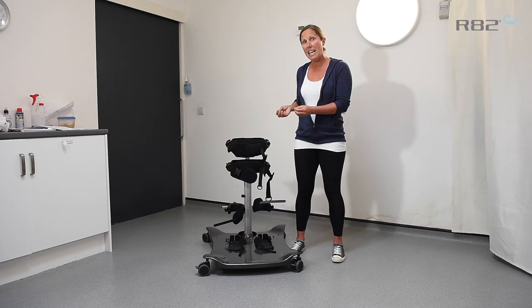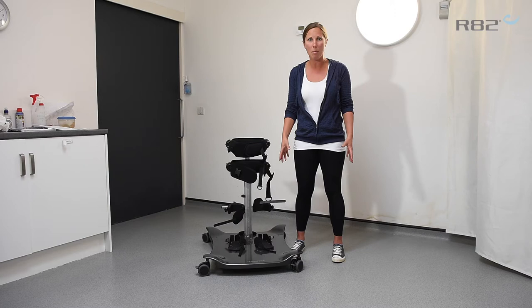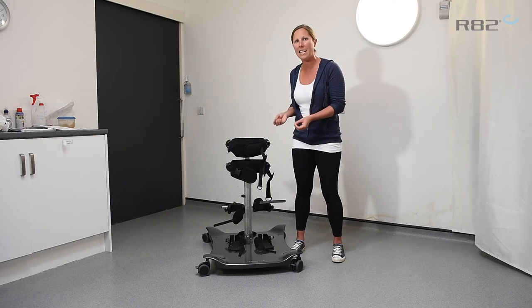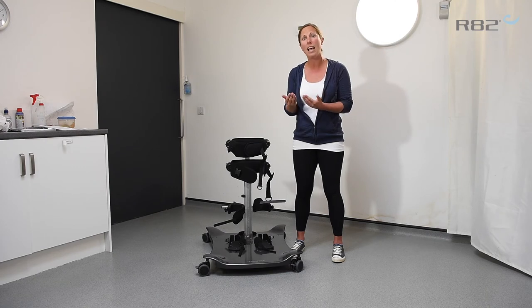What we can also do is put the rocker on the base, so we can keep static body alignment like we would do in any piece of equipment — which lots of therapists are using — but also then make it dynamic. So we're actually trying to challenge that postural control, both dynamic and static balance. And within doing that, we can start to improve and work towards our goal of improving motor skill performance.